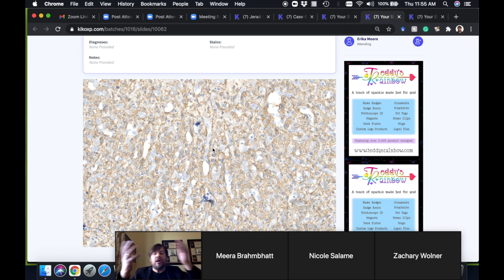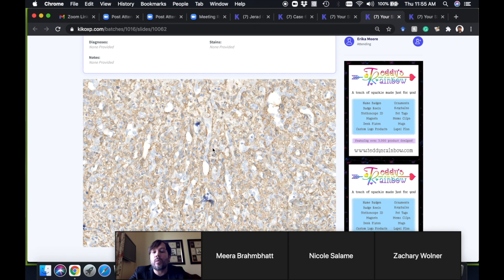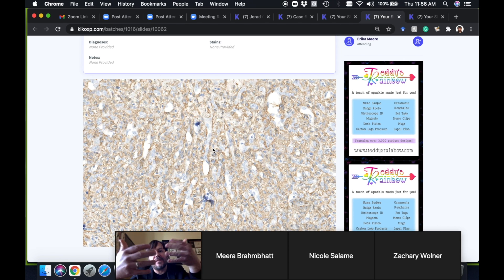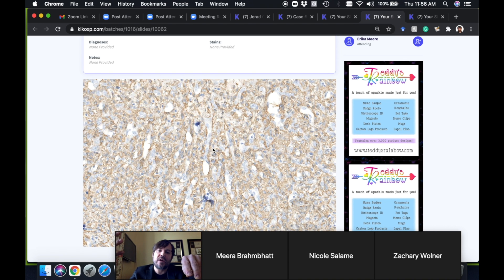It can kind of help you because it gives you the negative image of what you saw on the CD31. All the background cells in between the little vessels, those are actin-positive. Usually benign vascular things have a nice layer of actin-positive pericytes surrounding each of the vessels. Angiosarcomas sometimes lose that, although not always.